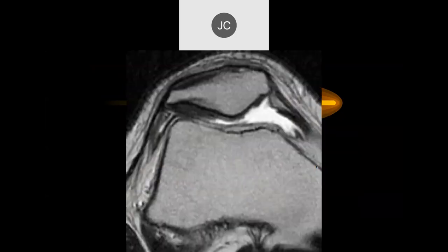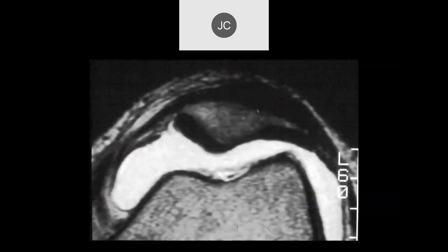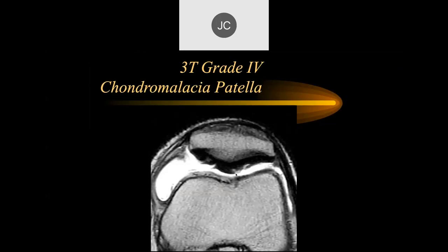Here's another case on a lower field scanner showing full thickness defects — grade 4 chondromalacia, chronic grade 4 chondromalacia on both sides of the patella. We can see multiple areas of deep fissuring, not all of which are probably grade 4, but this probably is a grade 4 coming in here.